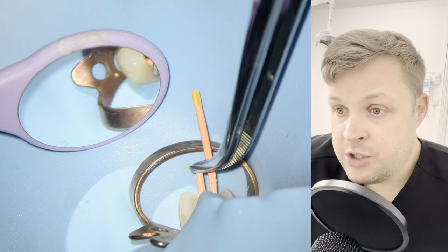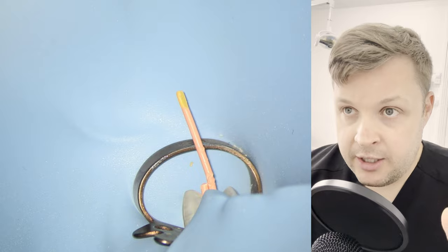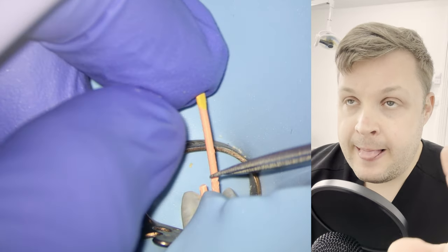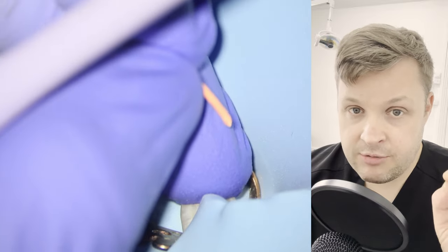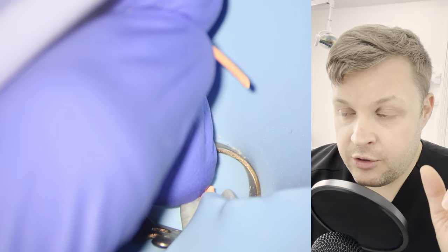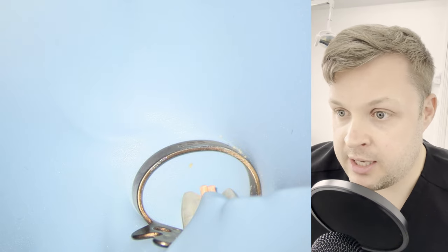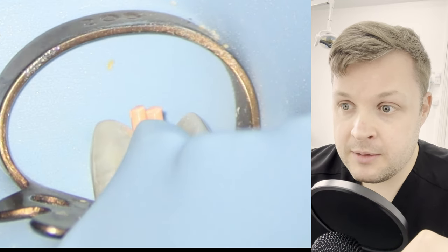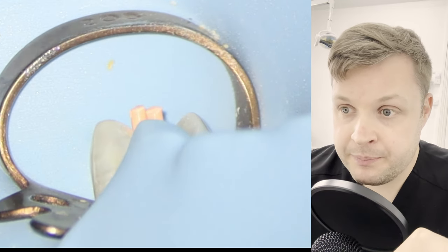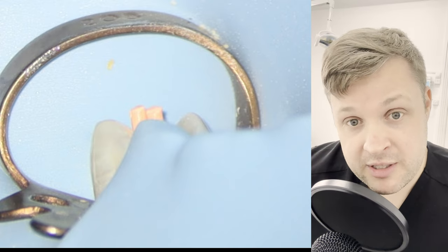So what I'm going to do now is take a cone fit radiograph — we're going to get the GP points in position and take an x-ray. Another indication that the canals join is that both GP points don't fit to length when they're in at the same time. And in this case they do both fit, so I'm not convinced they are joined.